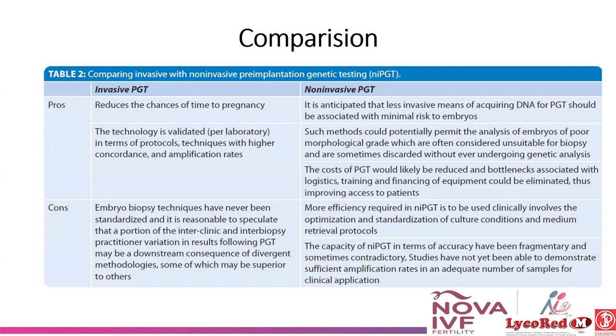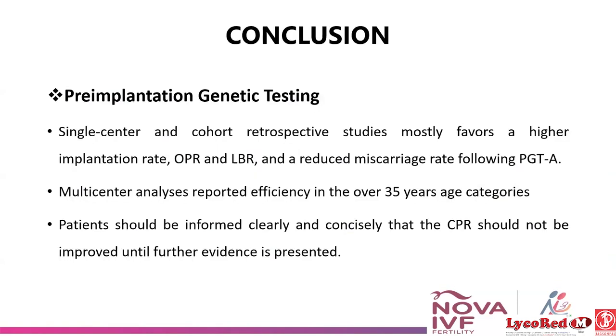And in non-invasive PGT, for more efficiency, clinical use requires optimization and standardization of the culture condition and medium retrieval protocol, because the collection of the media, the protocol, is still not standardized.